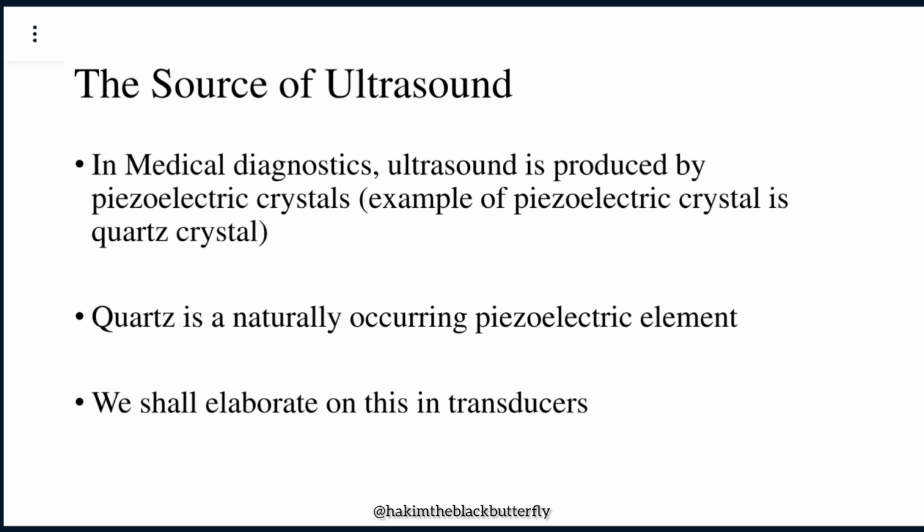So the piezoelectric elements that we use for production of ultrasound are transducers. The unique thing about them is that they are two-way transducers.